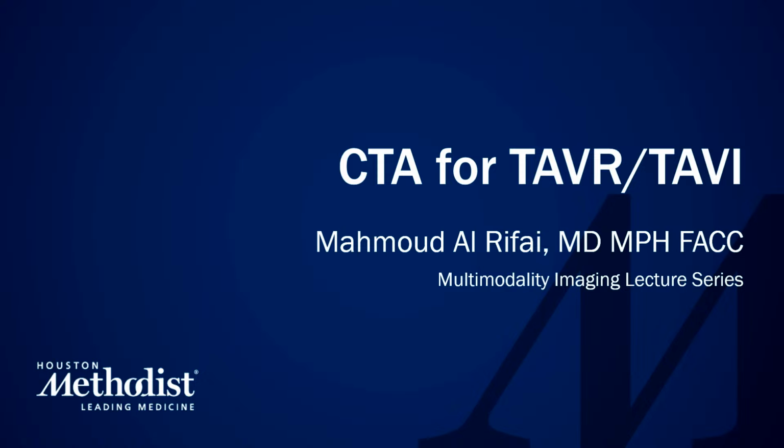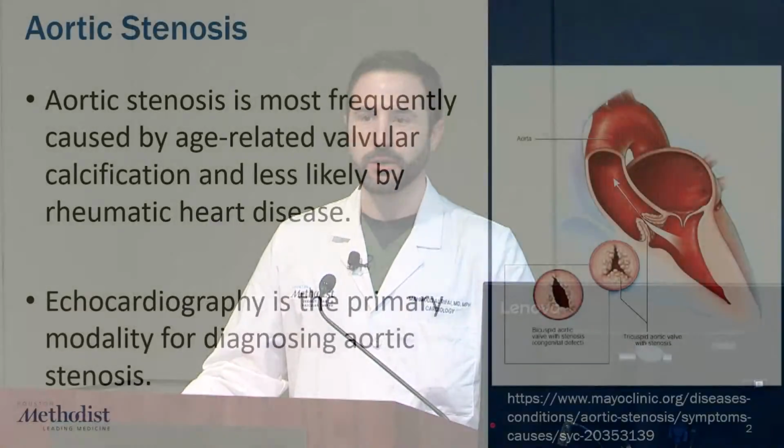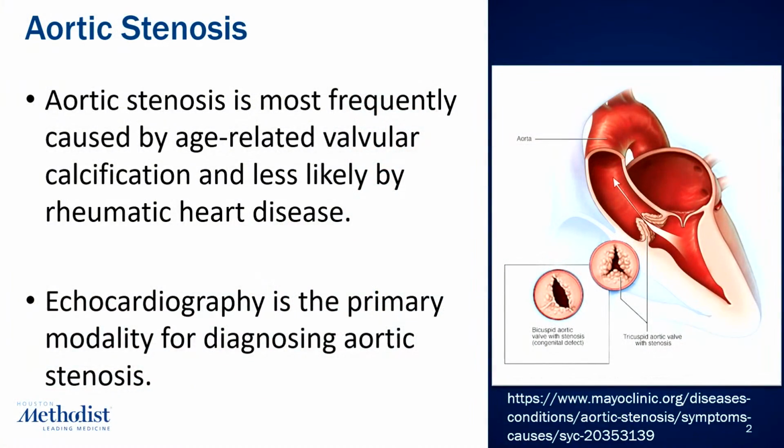So we're going to do a lecture today on the use of coronary CTA for TAVR and TAVI planning. All right. So today's topic is on aortic stenosis and how to use CTA for pre-procedural planning for TAVR.